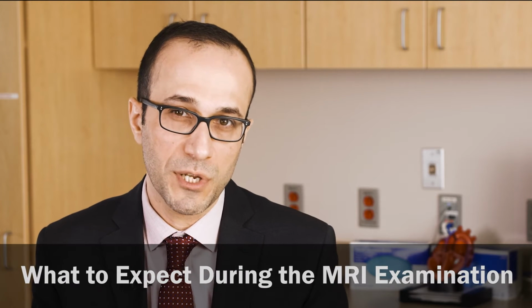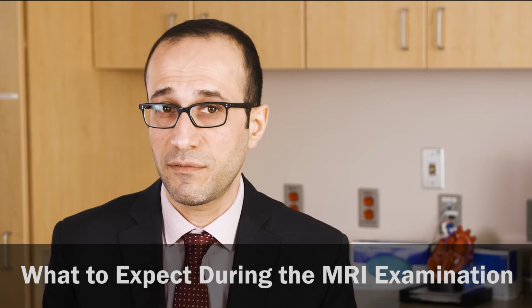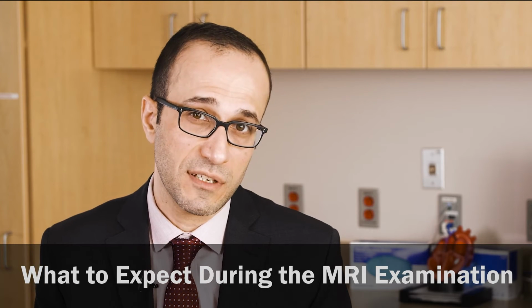I would like to briefly illustrate to you what to expect when you are scheduled for an MRI. If you had a discussion with your urologist and he thought that you may benefit from this test, you typically go to an imaging center where you will be lying flat on your back for approximately 30 to 45 minutes. The radiology technicians will go through a checklist to make sure you don't have any problem going through this big magnet, such as a foreign body or a metallic implant that may affect the quality of the images, or sometimes can move during the process of imaging. You would be asked to stay still as much as you can.